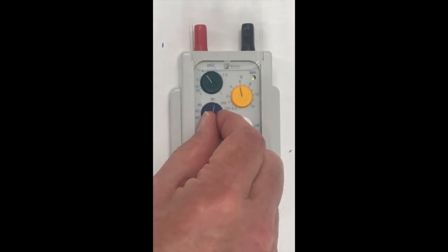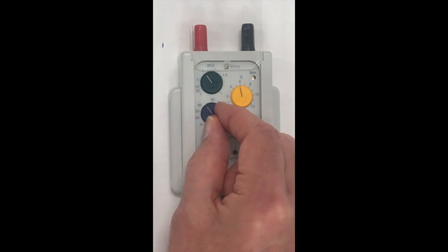I need to move the rate down to one which is lower than the intrinsic rate, so I'm going to set this down to around 40 beats a minute.